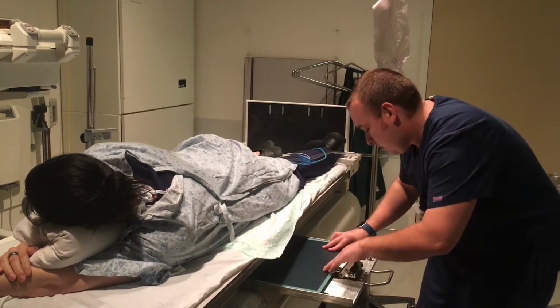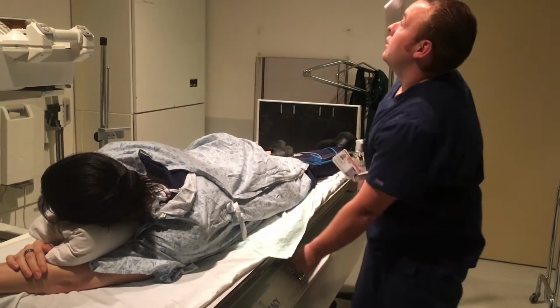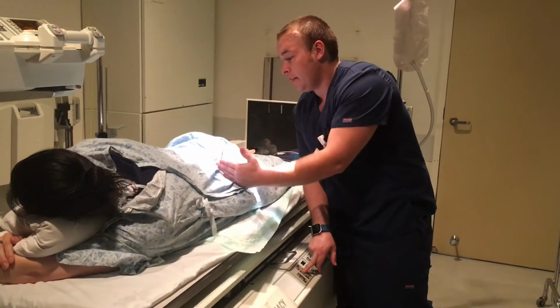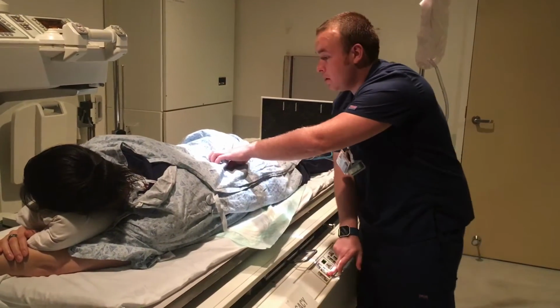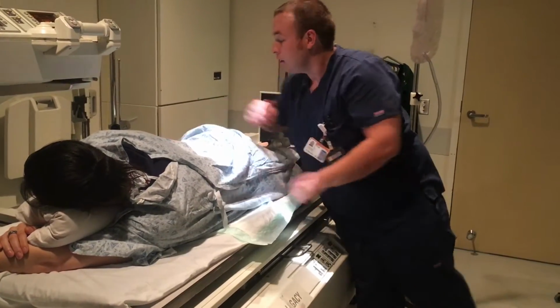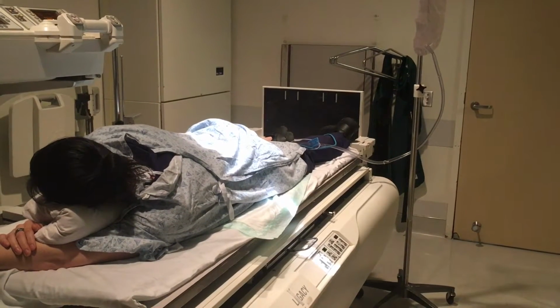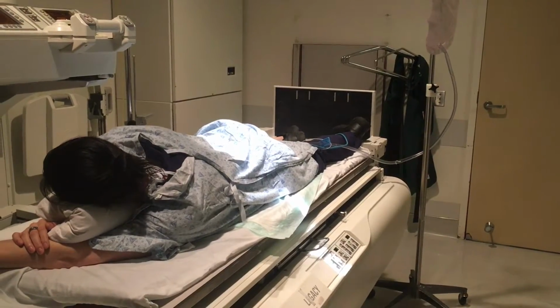Knee to seat, patient's left side still. Only thing I'm going to do different is reposition the patient. Mid-sagittal, iliac crest, 2 inches to the elevated side. That way we don't get any anatomy cut off. Same technique. Looks good. Taking a deep breath. Blow out. Hold. X-ray. Alright, you're doing good.